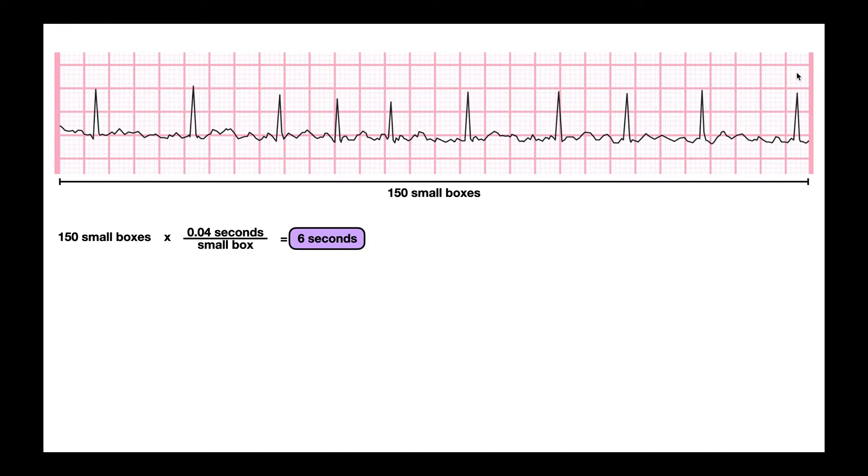So when we do the 6-second method, we're counting for everything within this entire normal EKG strip. To do the 6-second method, I'm going to count the number of QRS complexes. There's no special cutoff that you have to do because the entire strip is defined as 6 seconds. So I just count the total number of QRS complexes within this strip: 1, 2, 3, 4, 5, 6, 7, 8, 9, 10. There are 10 QRS complexes within this strip.